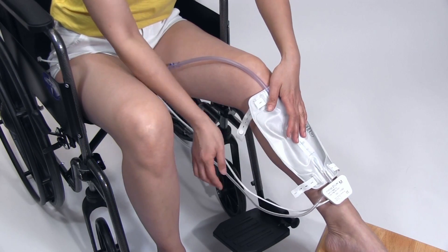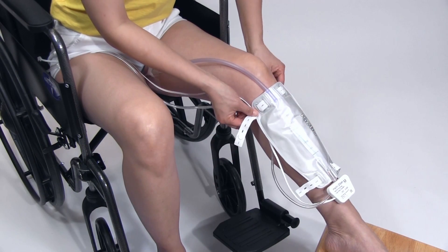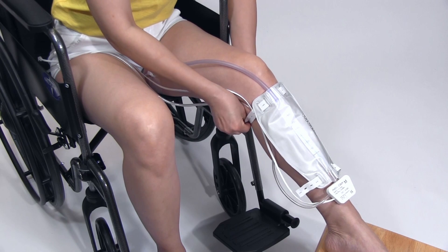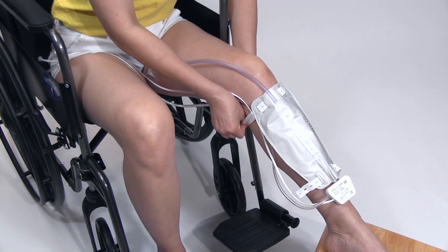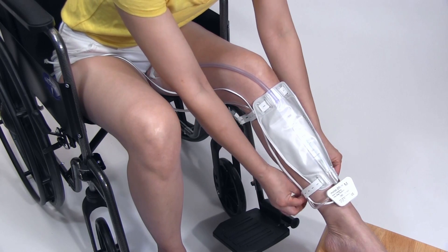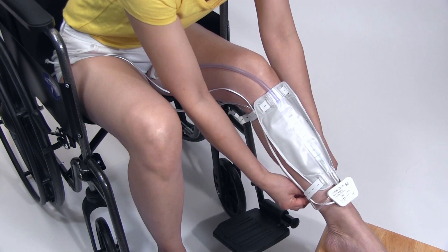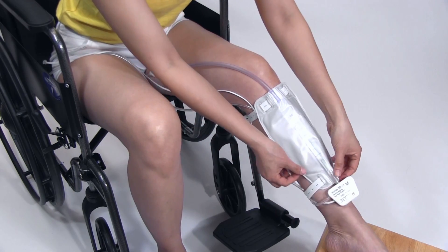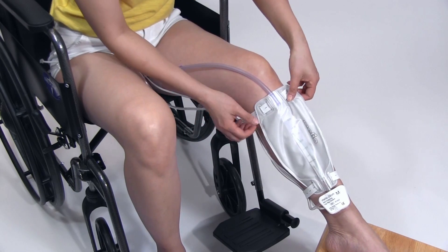Use the leg bag straps to fasten the bag securely to your calf. Adjust the position of the bag so it's comfortable.